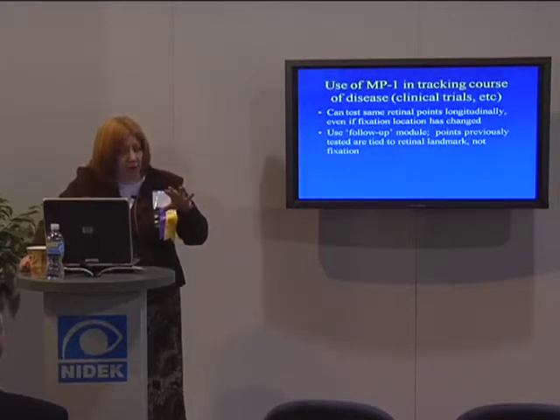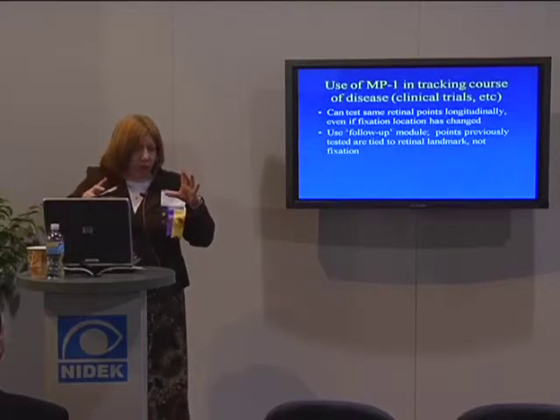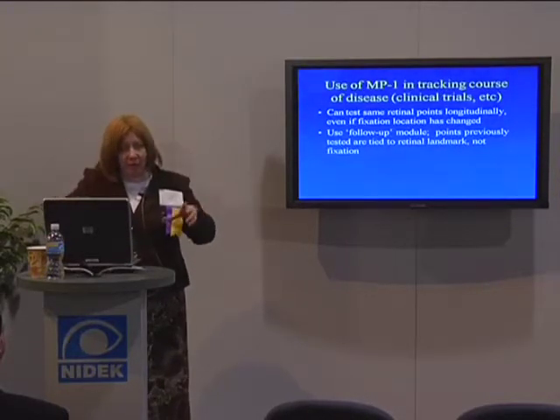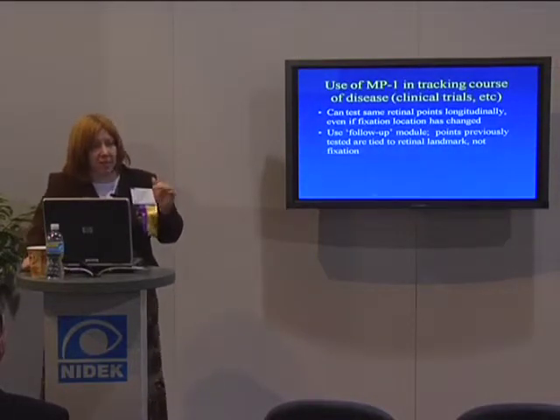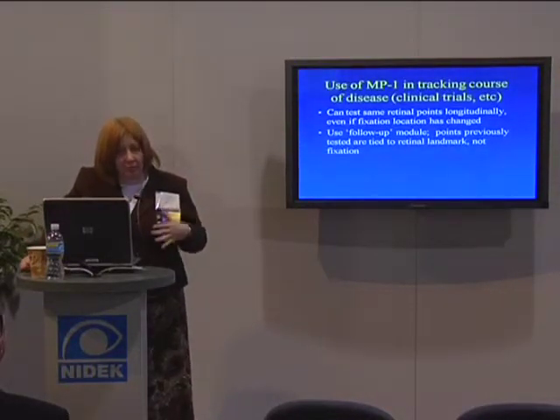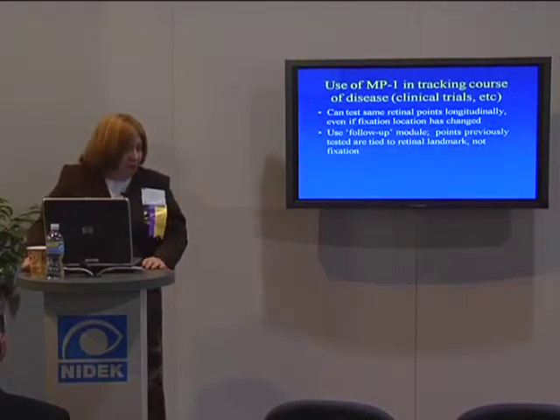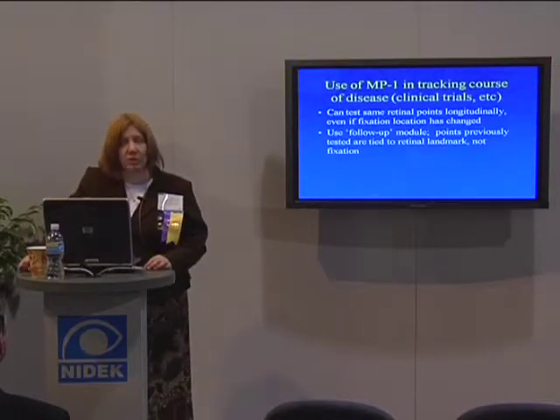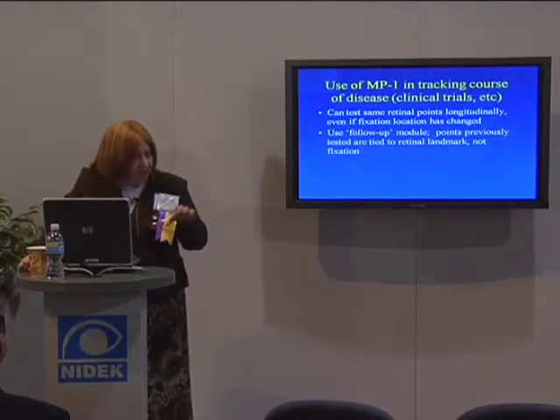if you imagine a person, let's say with geographic atrophy, who has a large scotoma, and you do some sort of regular conventional field, and the person misses, let's say you're doing 50 points, the person misses 35 of them. Now the next year they come back and the scotoma's enlarged, and so you're going to end up testing the same 50 points, and now the patient won't see 40 of them. Well, it's a very frustrating experience to sit there and not see most of the points, and also it becomes, you end up having few points in the area of interest.